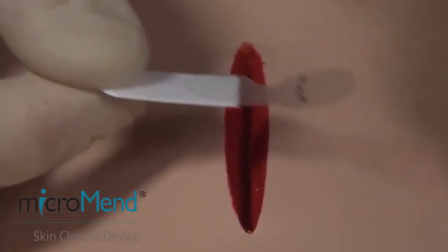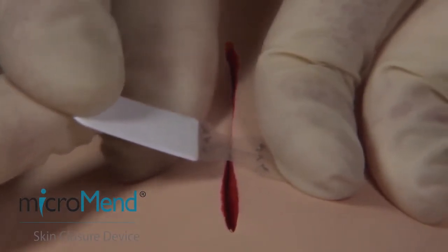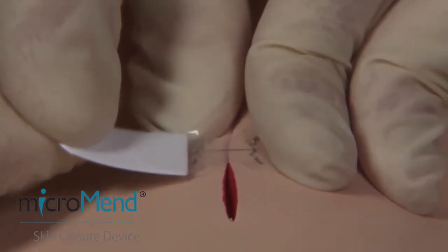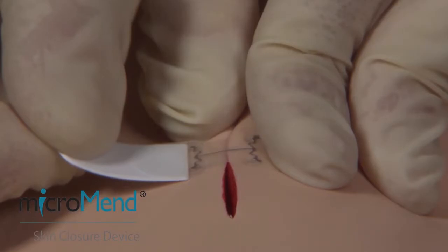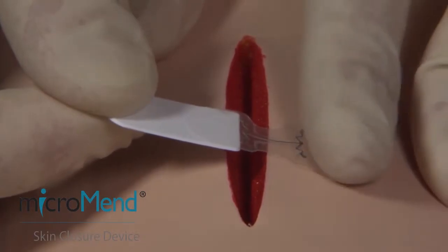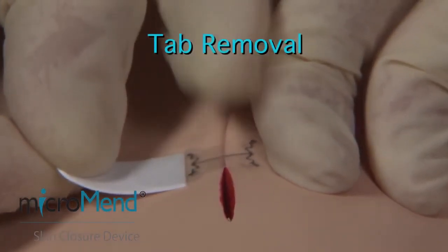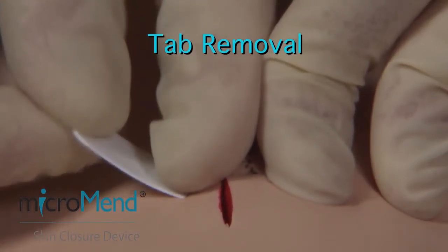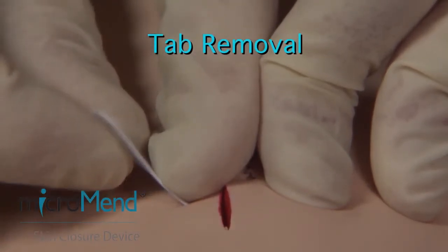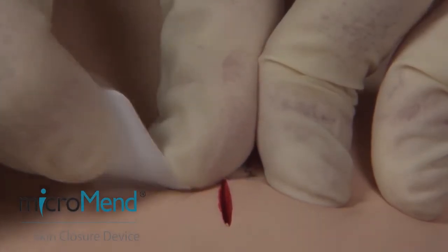Place the device over the center of the wound. Press firmly over the far side of the device to anchor the microstaples, and then pull across the wound using the white applicator tab. To remove the white applicator tab, press firmly over the microstaple area on the side of the device that contains the tab while pulling laterally to remove it.